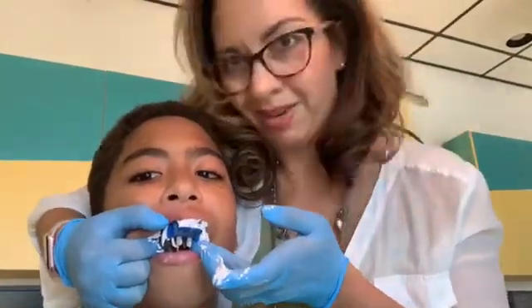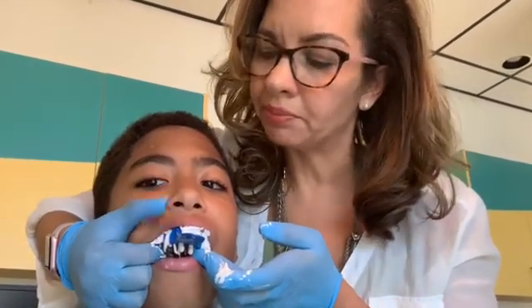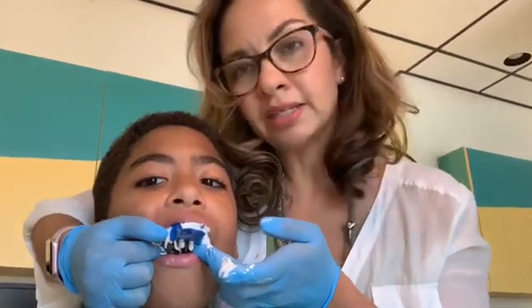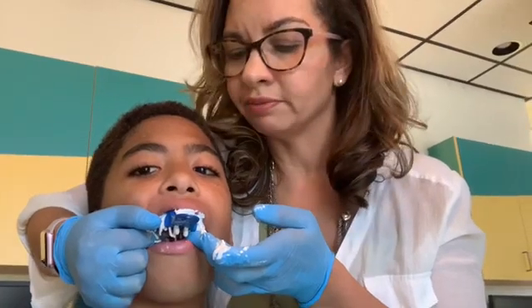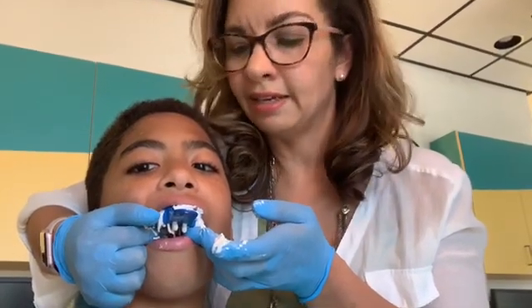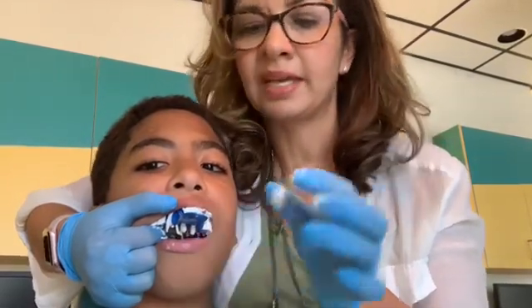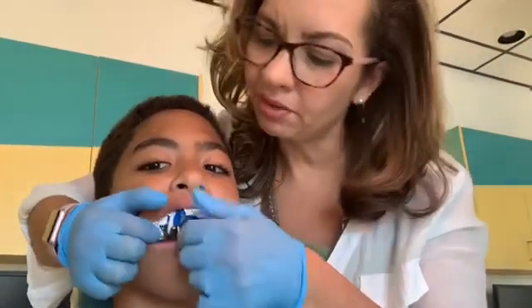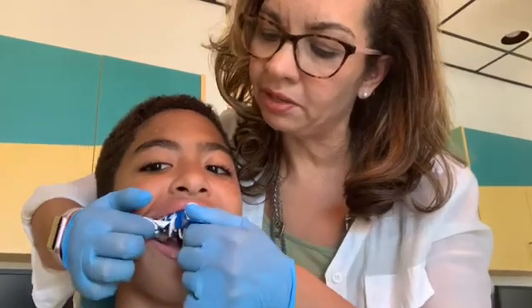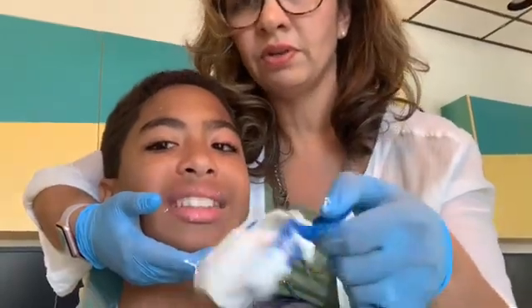Nicholas is an awesome patient, but if your child is gagging or has an excited gag reflex, you can tell them to breathe through their nose. I do a lot of distraction — wiggle your left toe, raise your right foot, wave with your left hand, wiggle your nose — all that happens so quickly they're distracted and the gagging subsides. Let's check it again — it's getting rubbery, so it's time to take it out. You were awesome. Unseal it and you'll hear the suction — perfect, perfect, perfect!